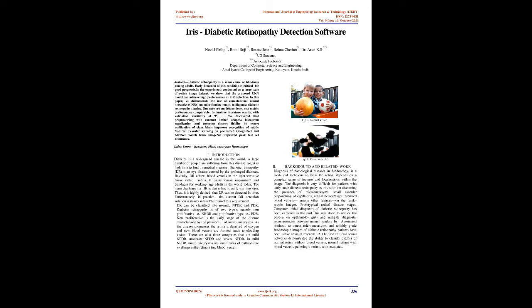DR can be classified into normal, NPDR and PDR. Diabetic retinopathy is of two types, namely non-proliferative, NPDR, and proliferative, PDR. Non-proliferative is the early stage of the disease characterized by the presence of microaneurysms. As the disease progresses, the retina is deprived of oxygen and new blood vessels are formed, which leads to clouding vision. There are also three categories: mild NPDR, moderate NPDR and severe NPDR. In mild NPDR, microaneurysms are small areas of balloon-like swellings in the retina's tiny blood vessels.